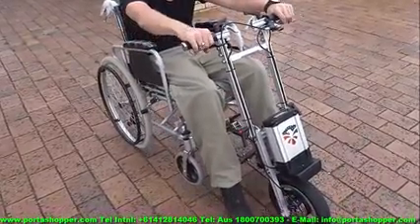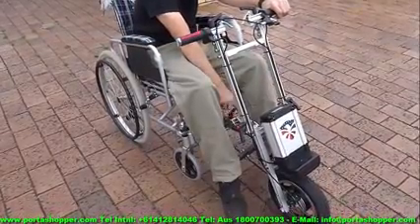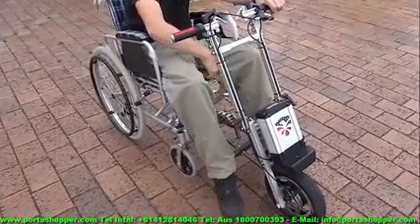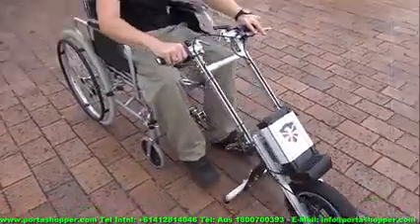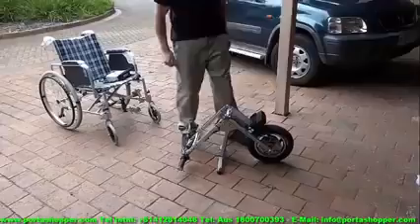Engage the wheelchair brakes again and reverse for an inch or two just to relieve the tension on the tow hitch, and then remove the safety bolt by twirling it anti-clockwise. While keeping the Porter Wheel brakes engaged, just lift the unlock lever and then you can let go of the brakes. Set it to forward then and use the throttle to move it forward and out of the way.